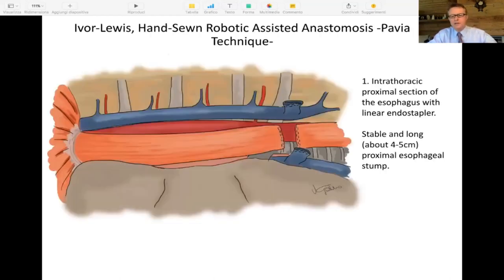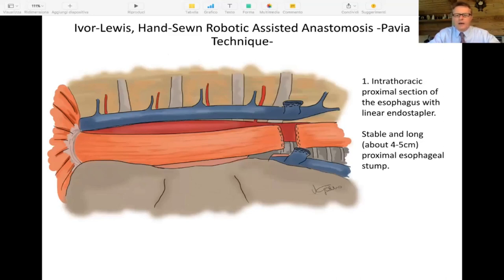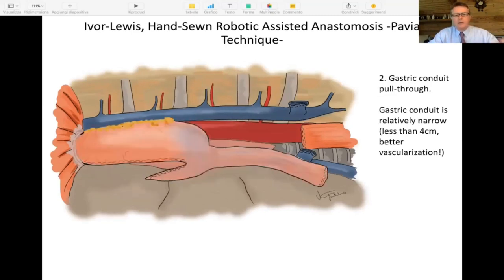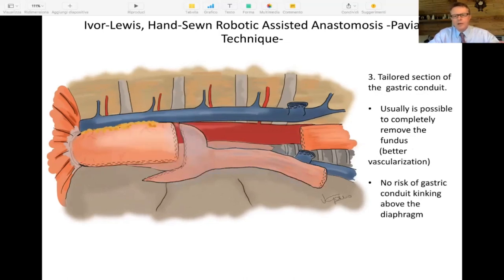The first step is to transect the proximal esophagus with the linear stapler at a reasonable distance from the visible cancer. For most cases of distal-third esophageal tumors, this is at the level of the azygos vein, leaving four or five centimeters of proximal esophageal stump available for the following anastomosis. We then pull through the gastric conduit. Another trick we use is to make the conduit as narrow as possible — less than four centimeters in diameter — which allows for better vascularization: the smaller the gastric conduit, the less vascular supply will be needed.